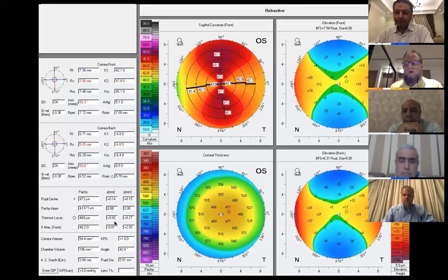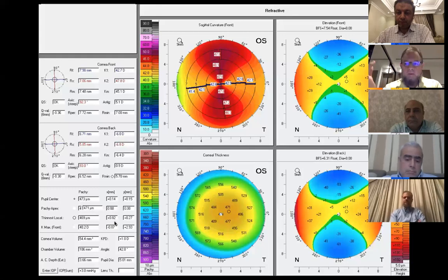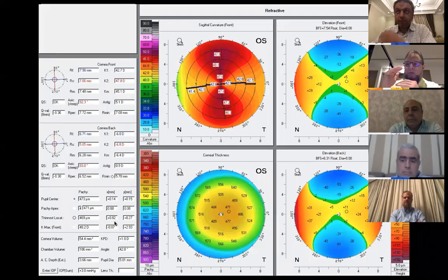Okay, great. Now let me clarify something. Corneal wavefront treatment is actually topography guided treatment because it is based on elevation maps. This is a misconception among many doctors. They think that corneal wavefront is a wavefront. The only real wavefront is the ocular wavefront, the total wavefront. So corneal wavefront means topography guided, but the difference is that in corneal wavefront, we can select the high order aberrations that we would like to treat. And this gives a privilege of reducing the ablation depth.